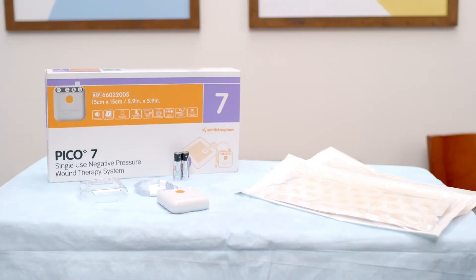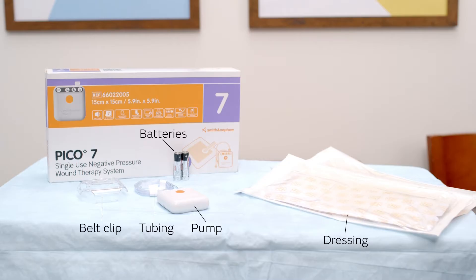Now let's take a look at everything that comes with your PICO system. The specific components include the dressing, the pump, tubing that connects them, batteries to power the pump, and a belt clip for portability.